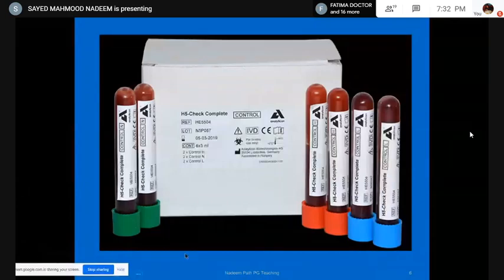We talked about control, and we said that there are three basic control levels. The blue color is for the lower control, the green is for the normal control, and the red is for the high control.